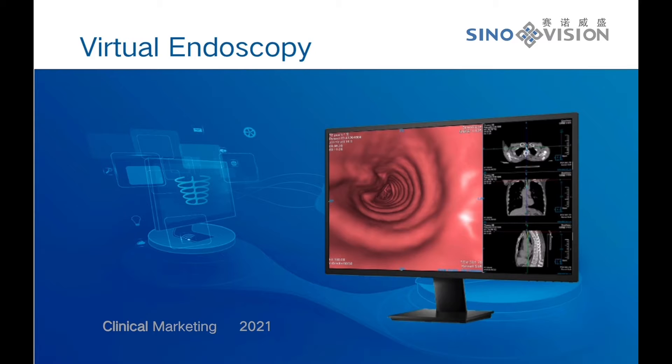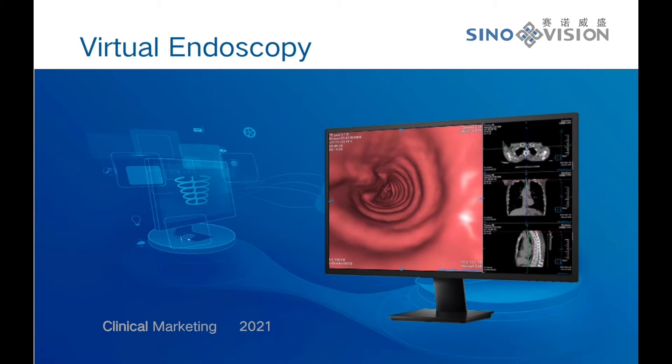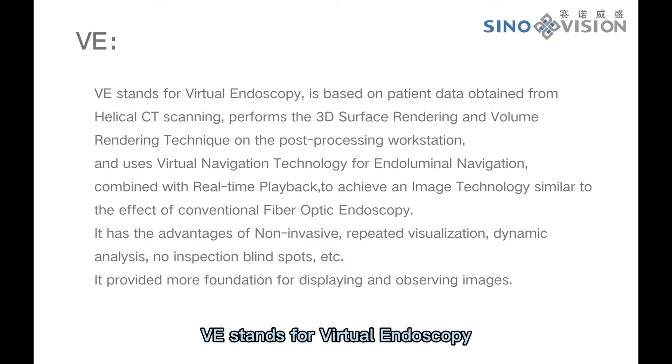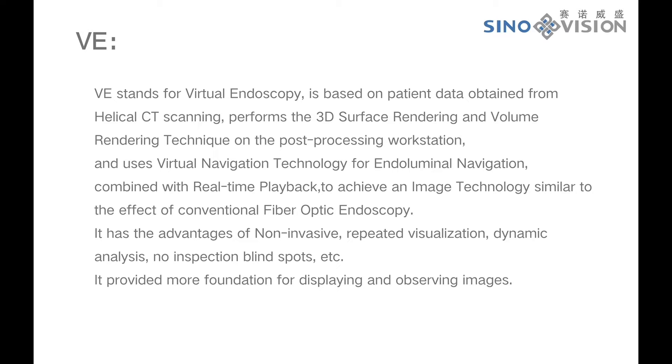Thank you for choosing SinoVision products. Today I will introduce the function and operation of the VE plugin. VE stands for Virtual Endoscopy.